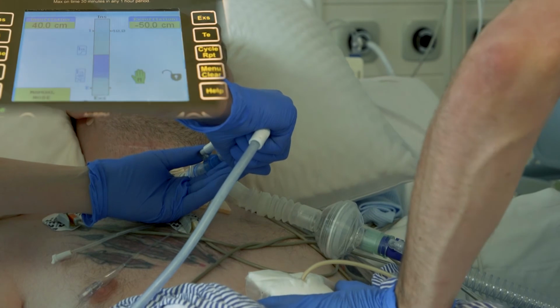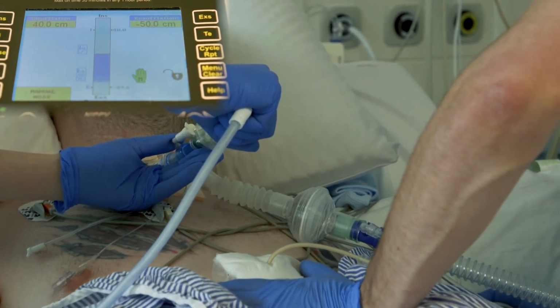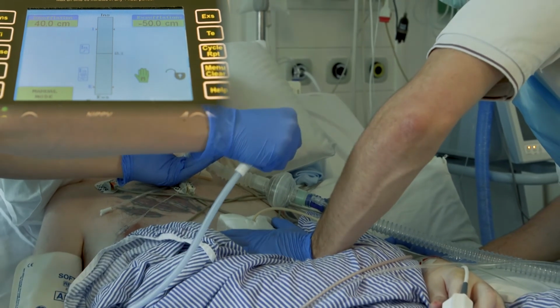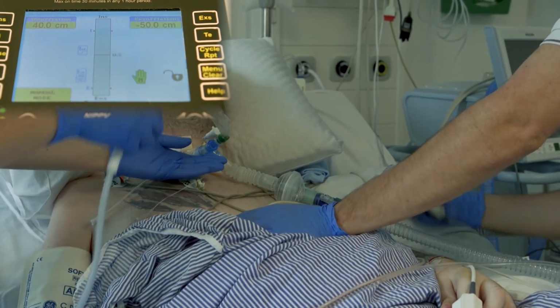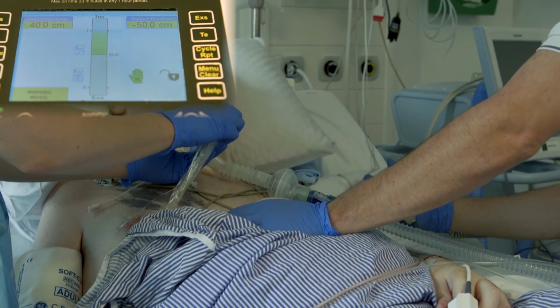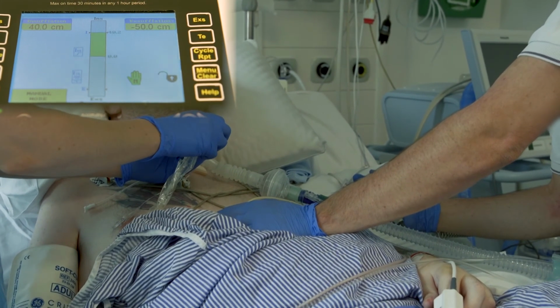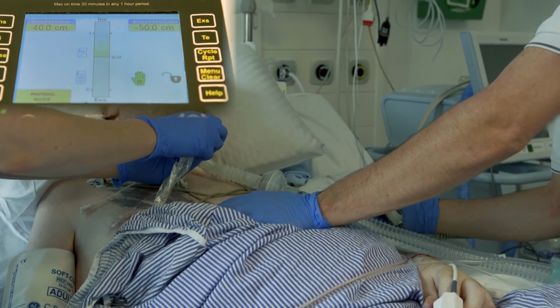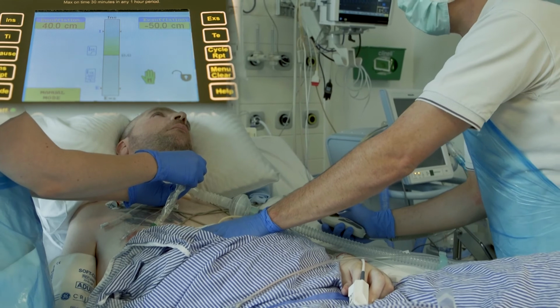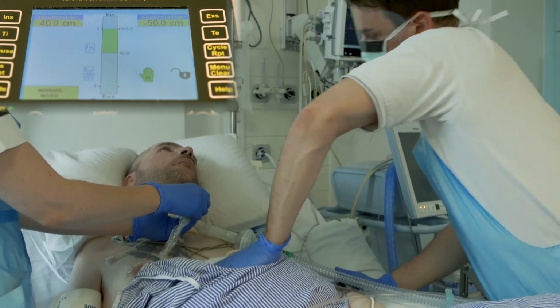A modified manual cough was also performed on each breath. You may decide that you just want to do this on the last exsufflation breath, but with the patient we see here, he had requested them on each breath as part of his treatment. As you watch the treatment, you will see that the physios perform the manually assisted cough together with the exsufflation technique.